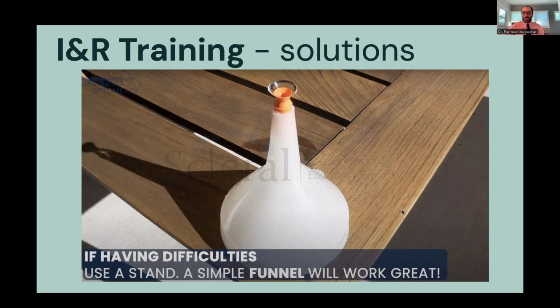It sounds really interesting. This is just your average home goods store funnel that you can buy. It's really inexpensive, and the diameter of scleral lens inserter tools fits so perfectly on the tip of these funnels that it acts like a stand. And when you have patients that have challenges with holding the lens, getting it in position to be able to insert, I find that this can help tremendously to make it much easier to get it on so they don't have to physically worry about holding the tool.